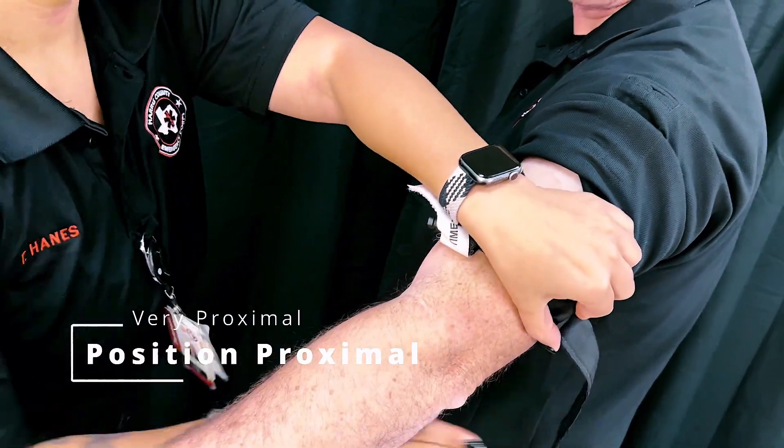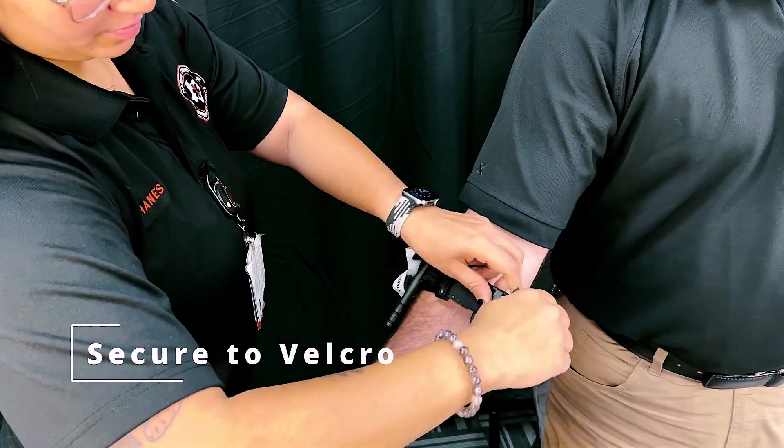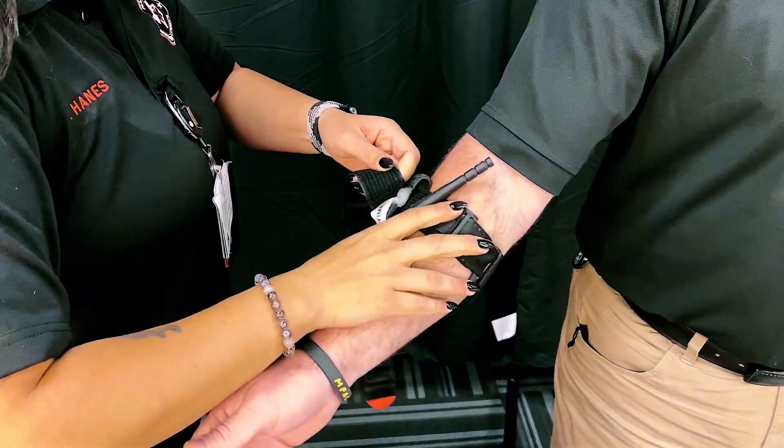If using the CAT on the upper extremity, place it proximally on the upper arm. Pull the band tight and secure it back on itself using the velcro surface. The CAT must be snug around the extremity.